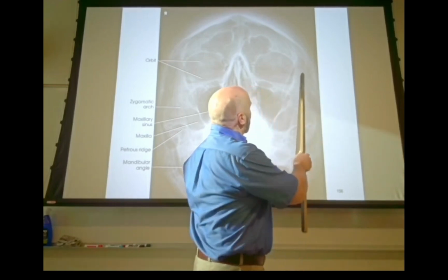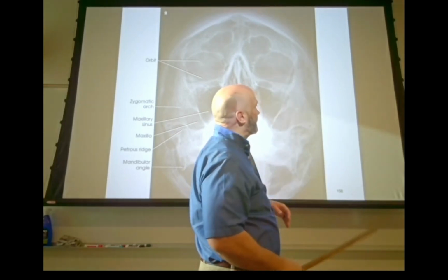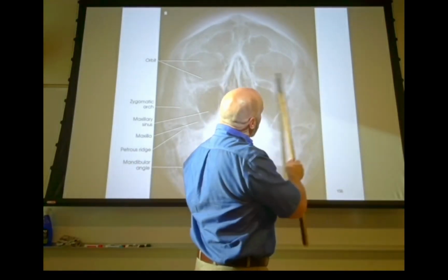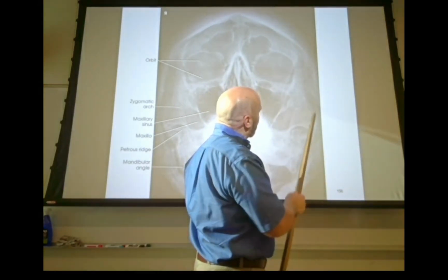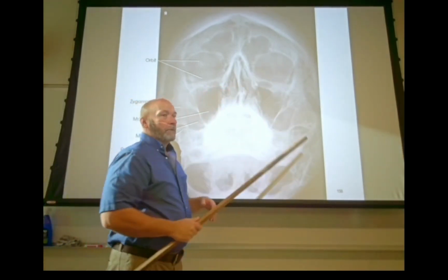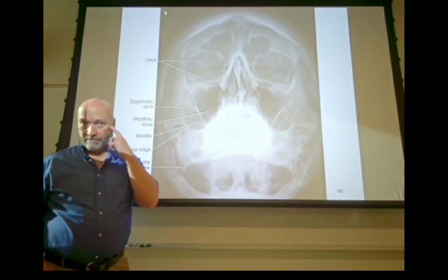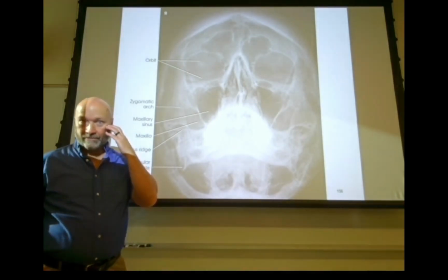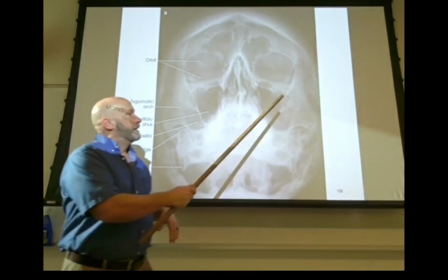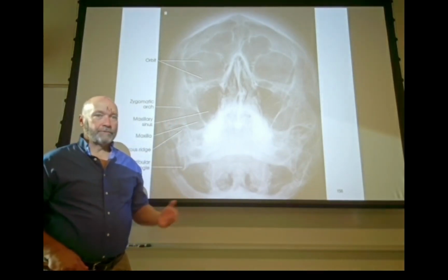You got this kind of a bump right here, big flappy thing, little tubular thing, kind of looks like an elephant. Can you kind of see that? Ear of the elephant, forehead, and that would be the trunk. And obviously what forms the ear would be the orbit. What forms the trunk would then be the zygomatic arch. All right, so that is, behind, let's say, nasal bones and mandible, that would probably be your third most common fracture of facial bones.